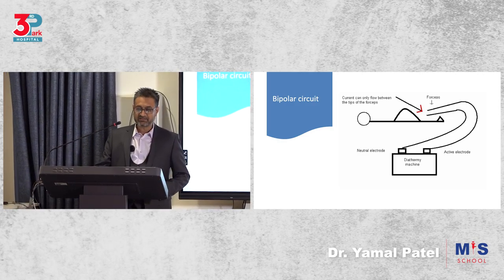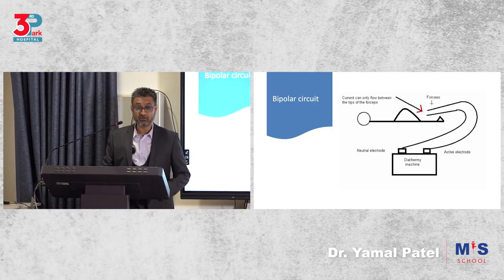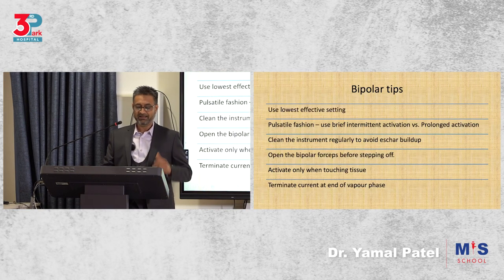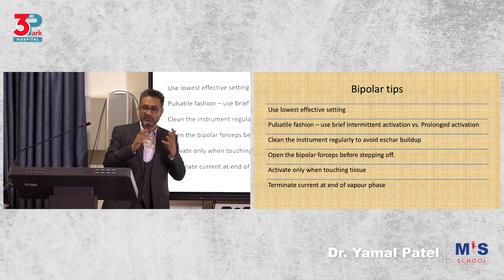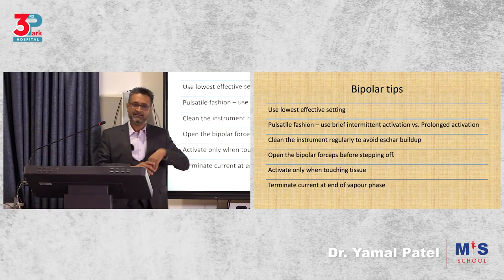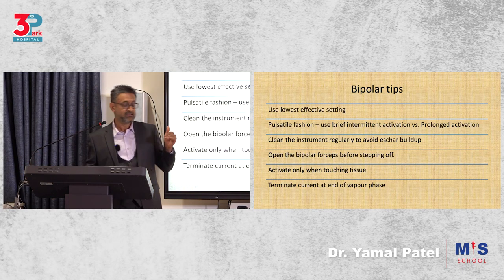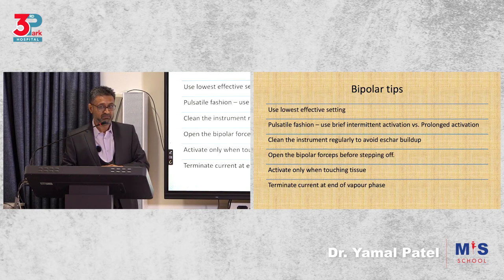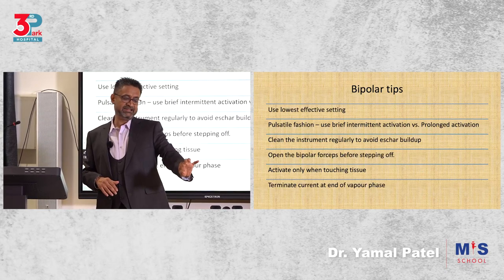Bipolar, we all know about it. It is safe because it's only between these two. It's not coming out through the patient. But the tips again: lowest effective setting, don't go high. If they say you work with 30, but you're getting a good effect with 20 or 25, work with 20 or 25. You don't have to go for 30. Pulsatile. Don't activate by holding.